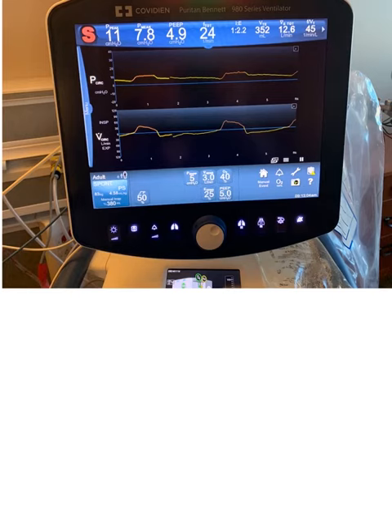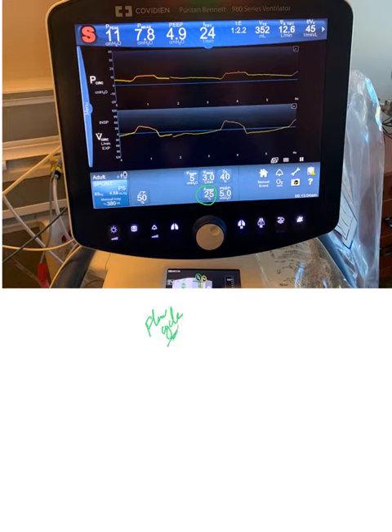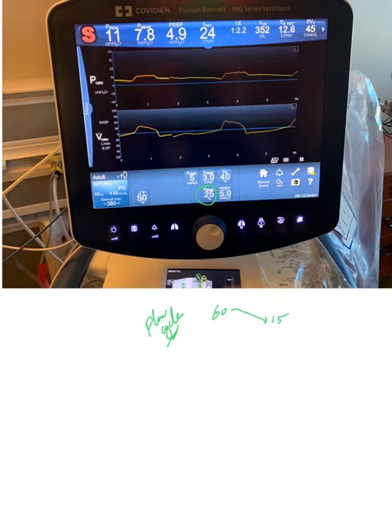Looking at this ventilator, you can see this number here — this is basically a flow cycle, or flow termination. We told the ventilator that as soon as the flow drops to 25% of its peak, terminate the breath. So if the initial flow was at 60, that means when it drops to 15, the ventilator terminates the breath.